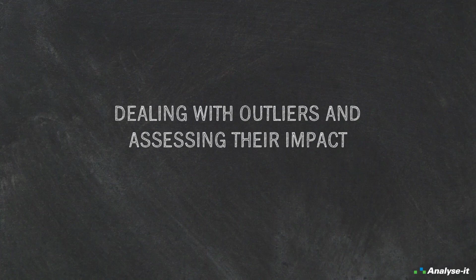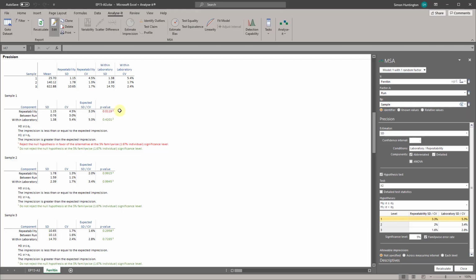There is always a trade-off between retaining the result, which will inflate the precision estimates, or excluding it, which may give overly optimistic estimates. It is often good practice to calculate the results before and after excluding the outlier to assess their impact. To create a new analysis excluding possible outliers, in the Analyse-it ribbon tab, in the Report group, click Clone.